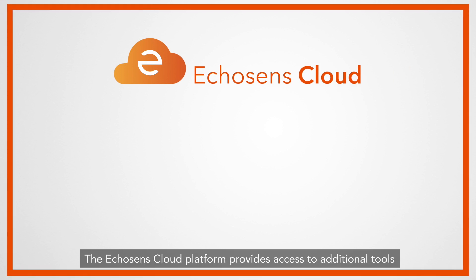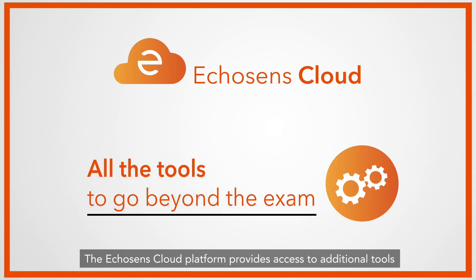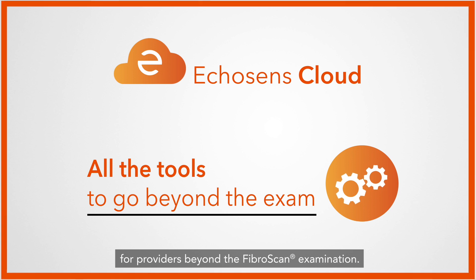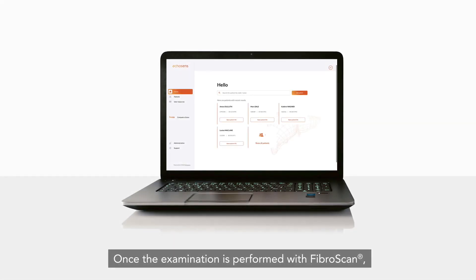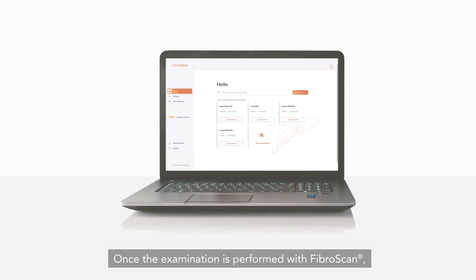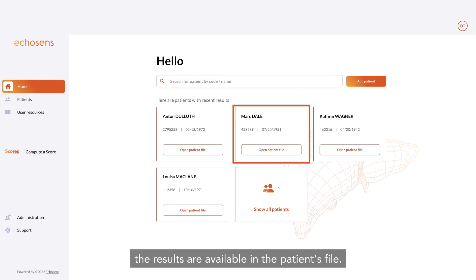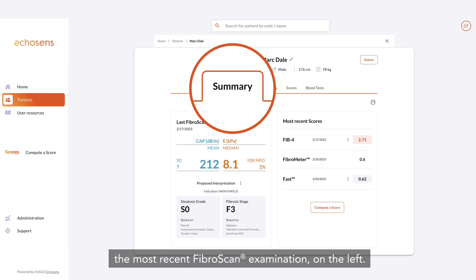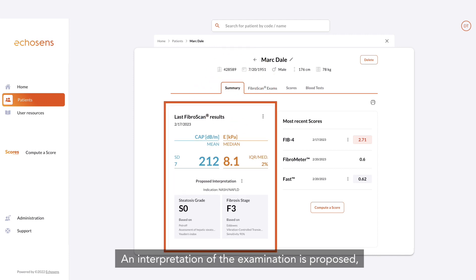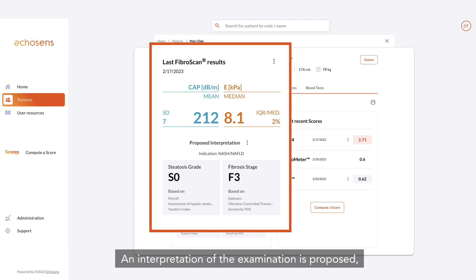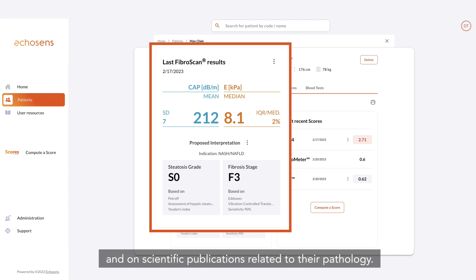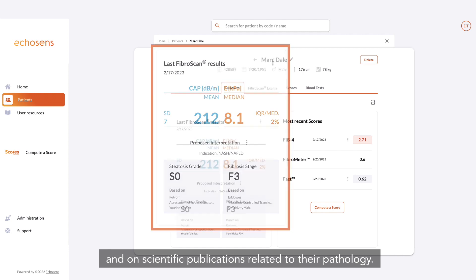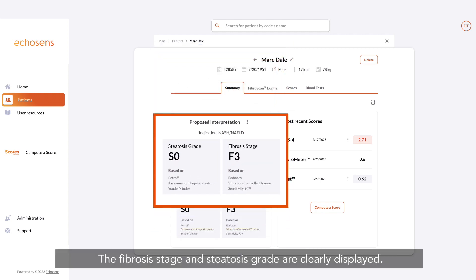The Echosense cloud platform provides access to additional tools for providers beyond the FibroScan examination. Once the examination is performed, the results are available in the patient's file. The summary tab displays the results of the most recent FibroScan examination. An interpretation is proposed based on the indication known for the patient and scientific publications related to their pathology. The fibrosis stage and steatosis grade are clearly displayed.